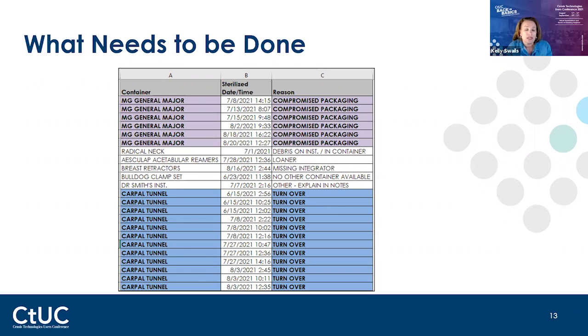So years ago, working in the OR, when we did our eye trays, we flashed, well, back then it was flashed, but we flashed all of our cataract trays. So on eye day, we literally had one person assigned as the eye room flasher, and that was their assignment for the day. And they would take that, go to the sink, wash it, and then put it in the sterilizer. So yes, this opens a whole can of worms with cleaning eye instruments, which we won't go down with the whole TASS syndrome. But you look at that and say, wow, this was crazy. And we got cited by Joint Commission.